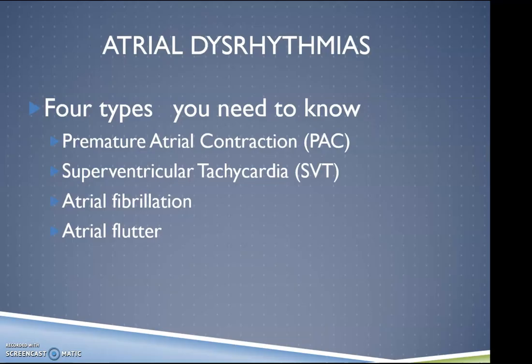There are a lot of different dysrhythmias. I'm keeping this very basic for you. You'll get more advanced EKG training if you work on a telemetry floor or an ICU, but we're sticking to some basic things to help you in the beginning get a good sense of what dysrhythmias are. We're going to talk about premature atrial complexes, or PACs, supraventricular tachycardia, or SVT, meaning it originates above the ventricles, atrial fibrillation, and atrial flutter.